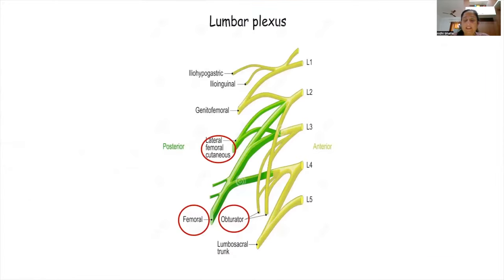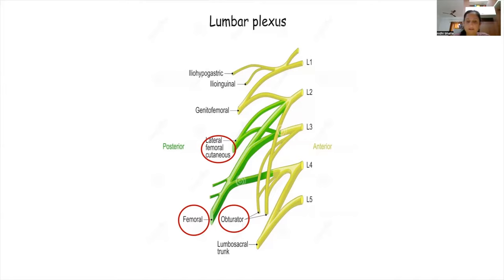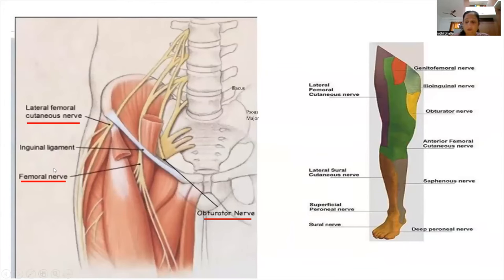By injecting local anesthetic into the fascia iliaca compartment, we target the three main nerves of the lumbar plexus: the femoral nerve, the lateral femoral cutaneous nerve, and the obturator nerve. These are the three nerves that pass through this compartment, and by depositing local anesthetic here, we primarily target all three.